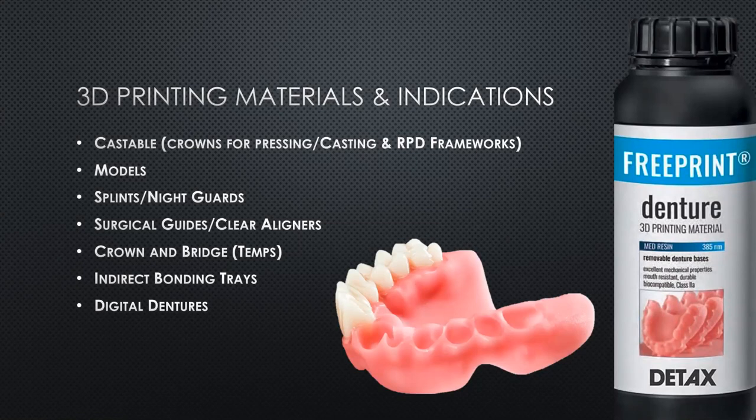For example, a proficient denture technician would typically set aside about 2.5 hours to complete a denture setup. And if they need to reset the denture teeth, it can take anywhere between half an hour to 45 minutes. With digital design in a program like 3Shape, this process of resetting teeth takes no more than 10-15 minutes maximum. These teeth are already programmed in perfect bilateral balance occlusion, so it's essentially a click of a button. Then, of course, you send it to your printer. You can send it and do a monoblock try-in while you're setting up another denture.